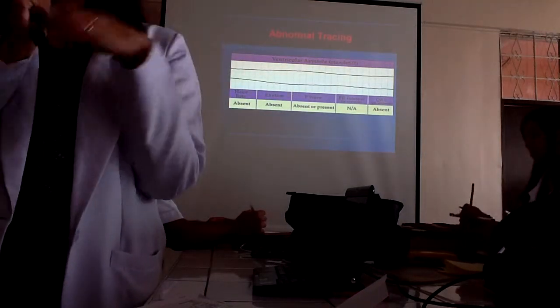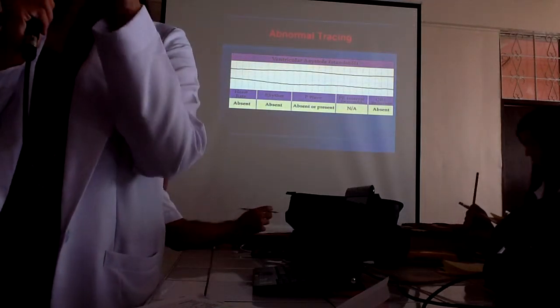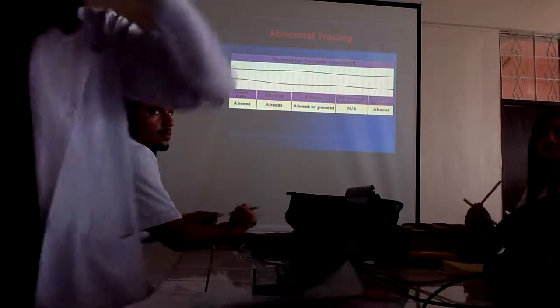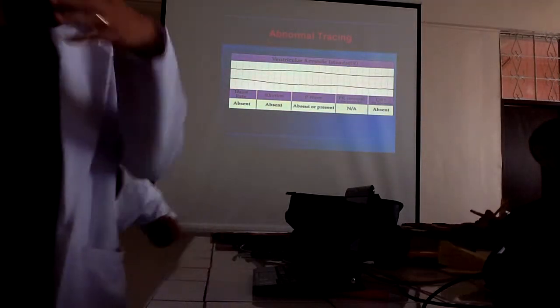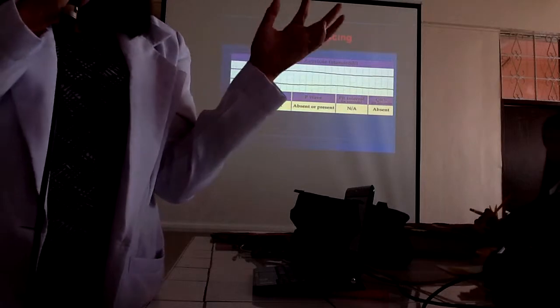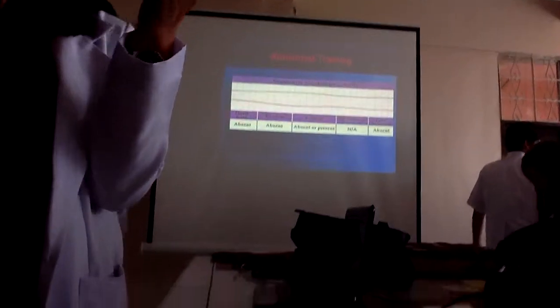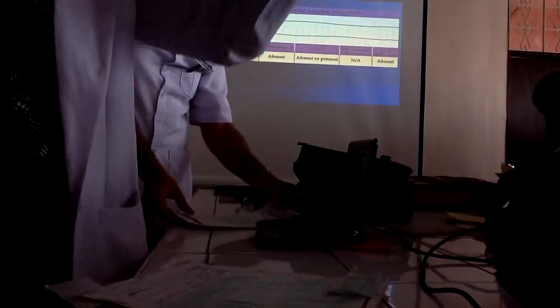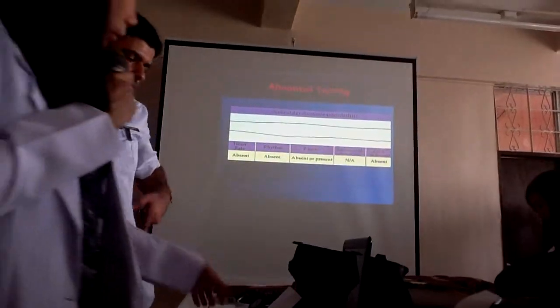So one per group. Group 1, 2, and 3, you can go to the last room. Have your ECG done. While the other groups, you can start borrowing your BP apparatus. BP taking is very easy. So just complete it. If you have a question on how to do it, raise your hand so I can go and see.